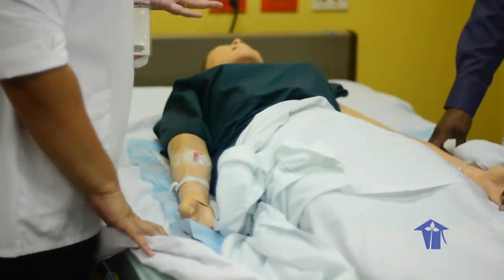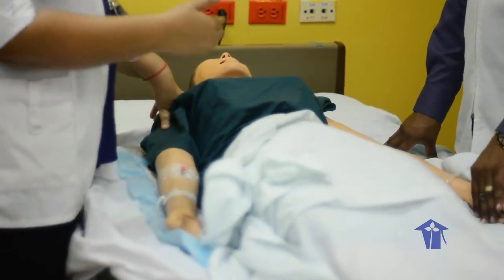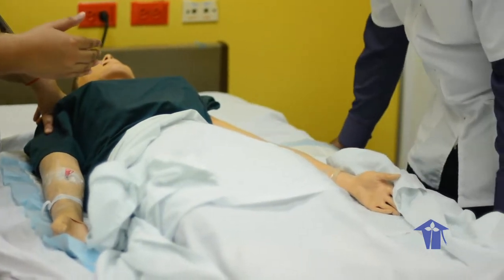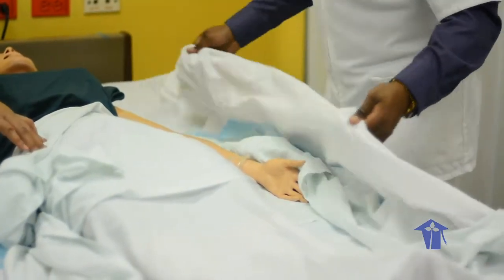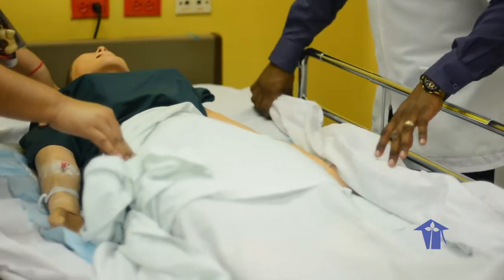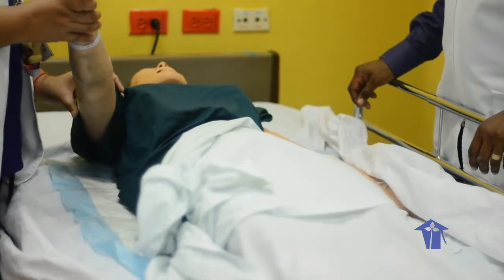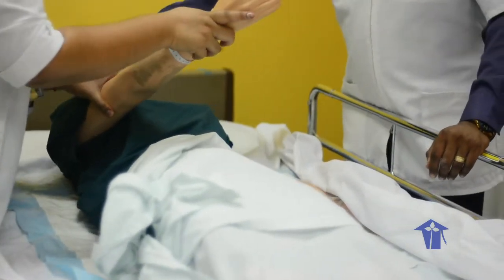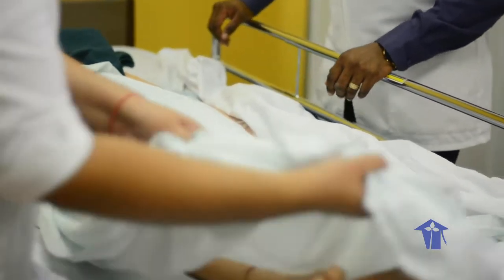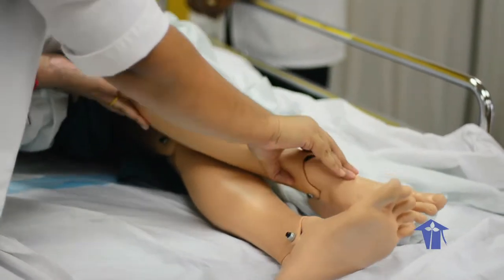Now we're going to roll the patient. Because I'm going to roll the patient towards Mr. Karim, I will tell Mr. Karim to raise his side rails. So that will help support the patient so she doesn't fall, okay? If your patient can help roll themselves, you will tell the patient to do so. Meaning you can take their hand and tell them to hold on to the side rail so they can pull themselves over, all right? You raise the patient's feet, knees, putting it over to this side.